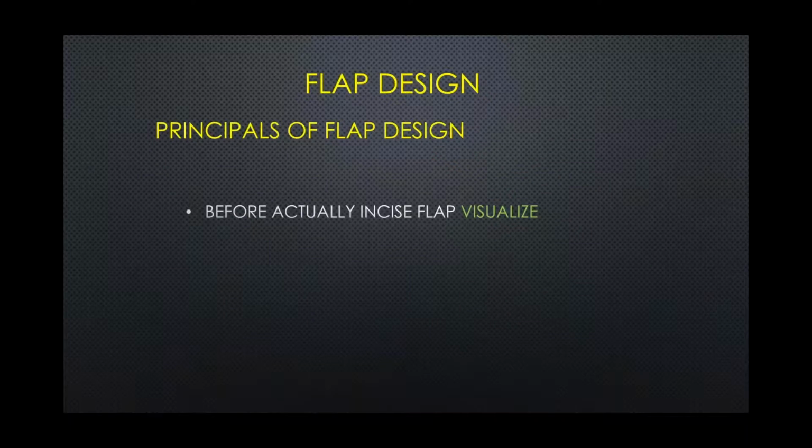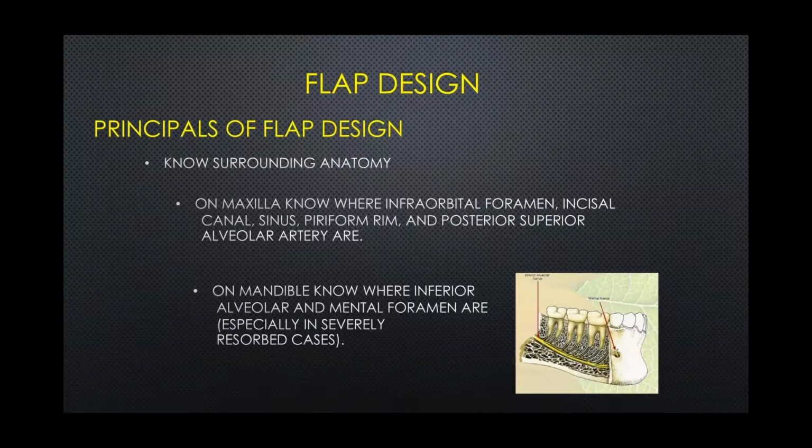Okay, flap design. The principle of flap design is what I like to say: before you do anything at all, always visualize what you're going to do. So if you're going to make a flap, visualize in your mind what structures might be associated with that flap. If you're going to take a tooth out, you do the same. Of course, we need to know our anatomy, and that's why we spent the first part of this webinar talking about it. It's very important to know where all these bony, blood vessel, and nervous tissues lie.